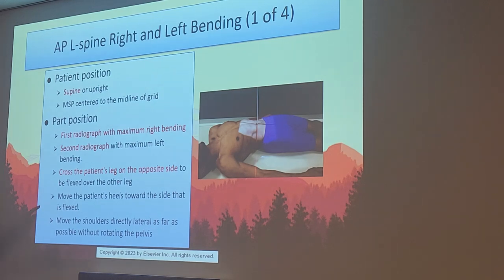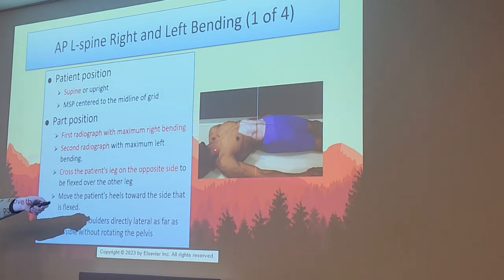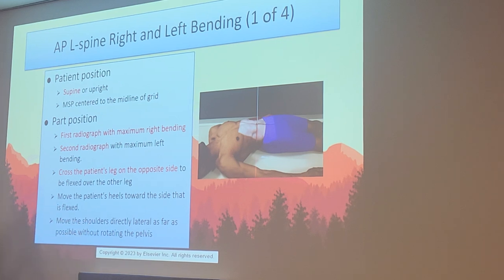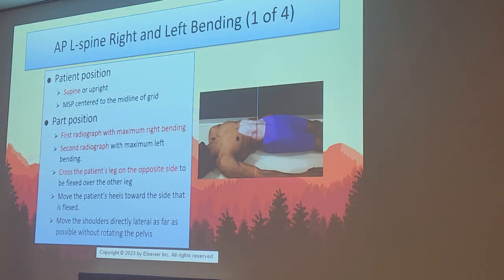So in other words, this picture up here, he's bending his body to the right. He's crossing the left leg over his right leg. I think it's to help keep the hips non-rotated, if I'm not mistaken. That's why they do that. And he said it's like scoliosis more? Yeah, we're going to get to that. It's for double-checking scoliosis, and I think it's like a spinal fusion, if I'm not mistaken. I might be thinking of flexion extension, though.